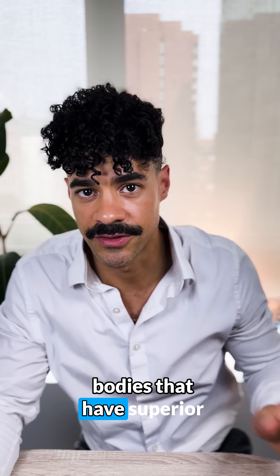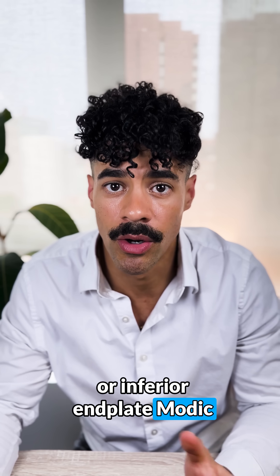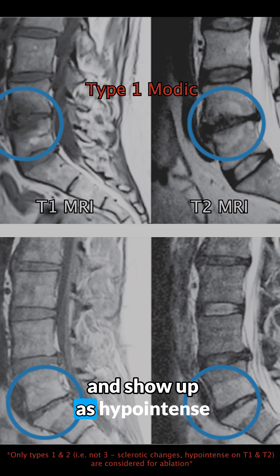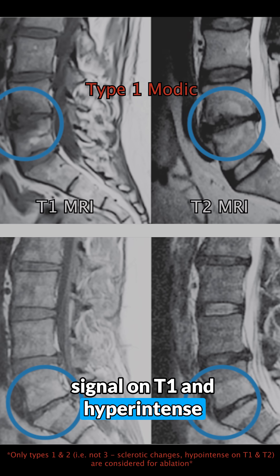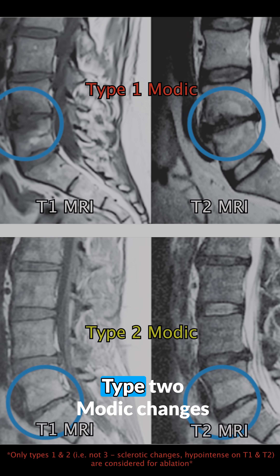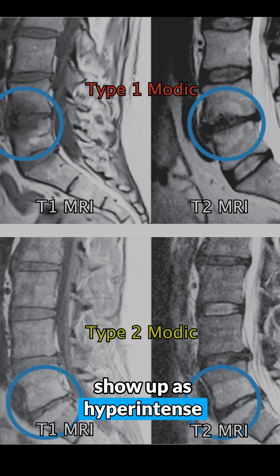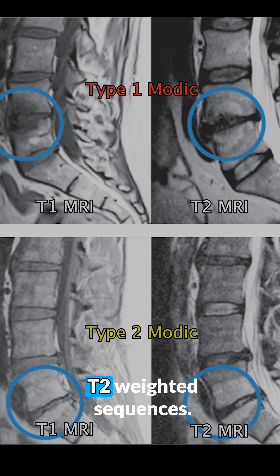We target vertebral bodies that have superior or inferior endplate Modic changes, for which there are three types. Type 1 Modic changes reflect active inflammation and show up as hypointense signal on T1 and hyperintense on T2 MRI sequences. Type 2 Modic changes represent fatty bone marrow replacement and typically show up as hyperintense signal on both T1 and T2 weighted sequences.